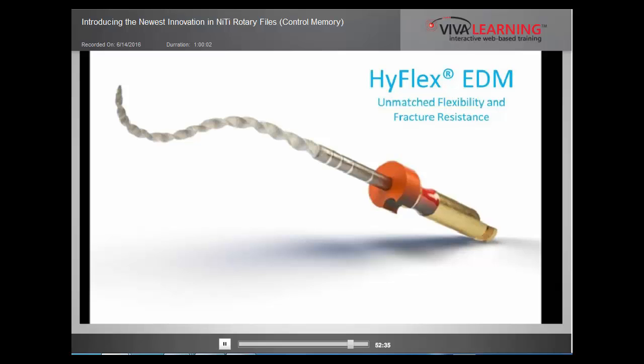This is not related to this, but I'll answer real quick. When the gutta percha goes through the apex, basically they fitted a cone that was long. Does this cause an issue with the future of the tooth's lifetime? First of all, that means you over-enlarged the apex. You've basically perforated and torn that apex, and you did not control your length very well. So that should not be happening.